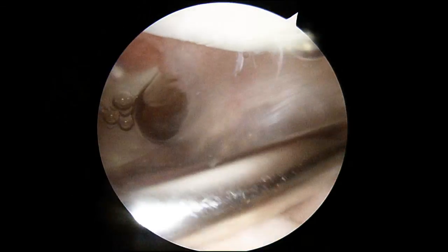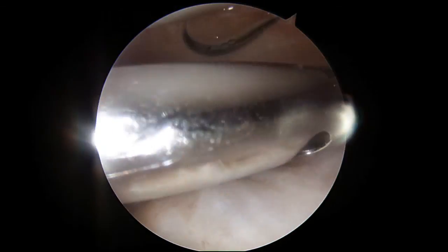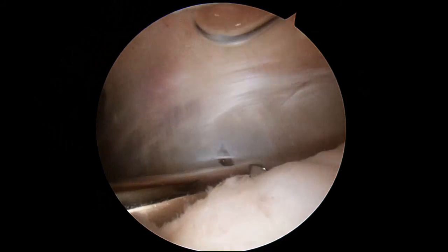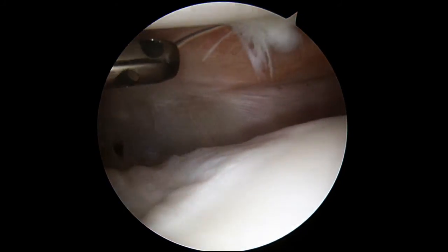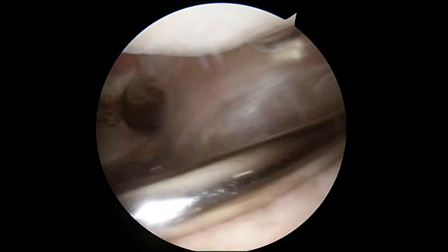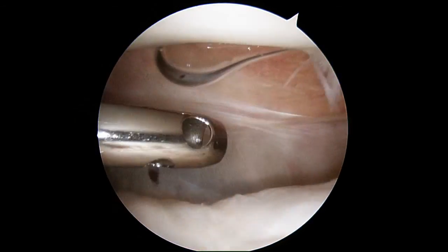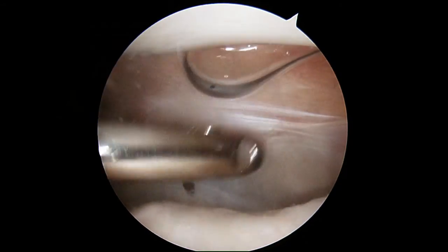Okay Dean, it's March 25th, 2013, doing a right knee arthroscopy. We're having a look — this is a little drainage tube that I have in your knee, about five millimeters in diameter, so it's pretty small.